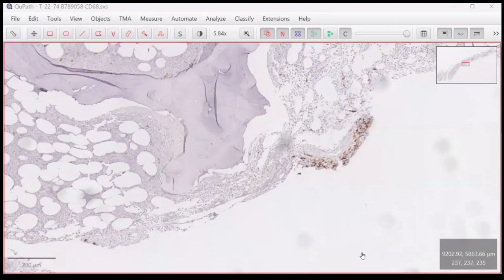I think instead of repeating CD34 and CD117, I would like to confirm with immuno for E-cadherin and also glycophorin A or C. This is because we need to confirm immunohistochemically, not only by H&E, as H&E is sometimes limited by the staining pattern.